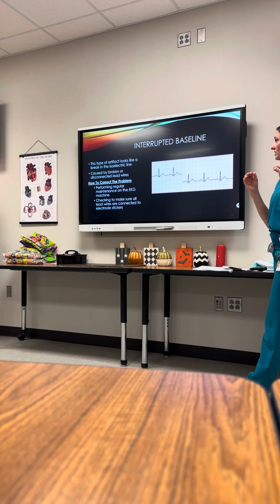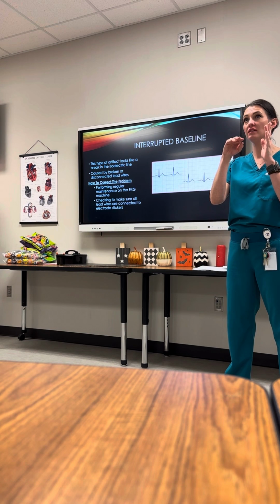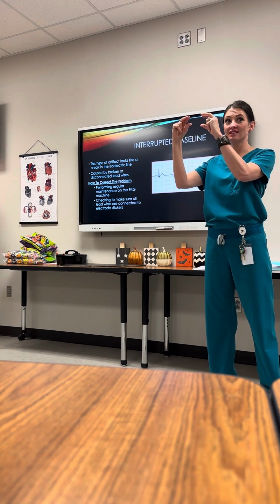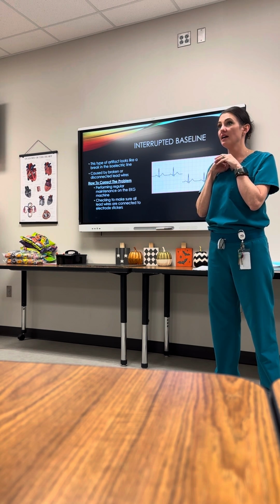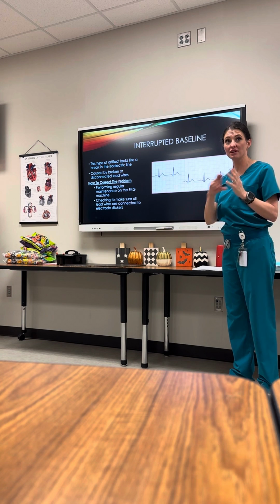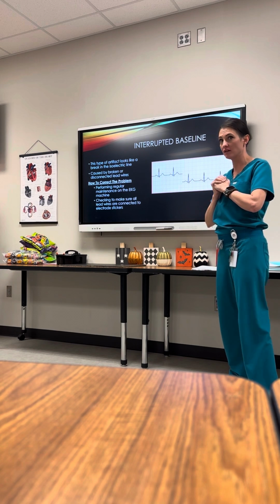Some of our machines will print out a 12 lead EKG and the isoelectric line is in a different place from lead 1 to AVR. So it looks like interrupted baseline, but really you're looking at two different views, if that makes sense. You guys following me? That's not interrupted baseline. If we were looking at a continuous feeding of, let's say, lead 2, and I had this happen in the middle of that tracing, that's interrupted baseline, okay?